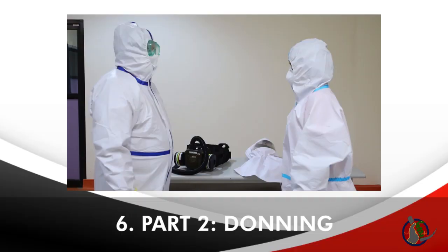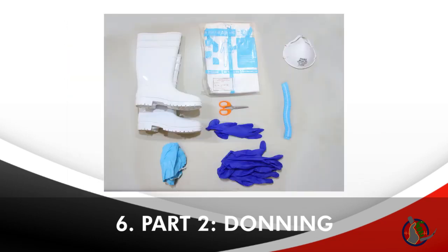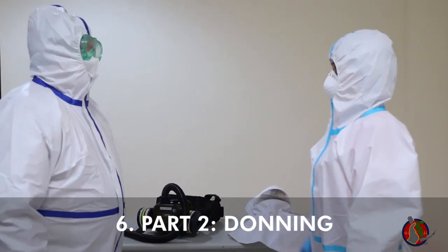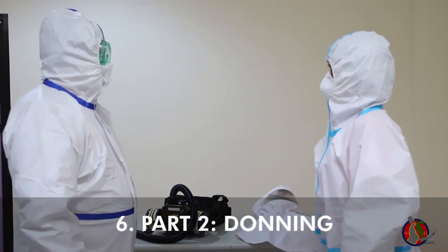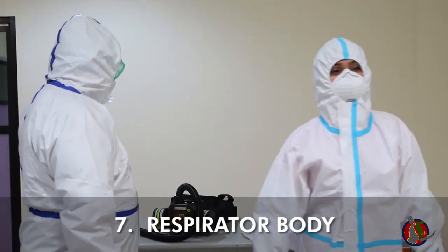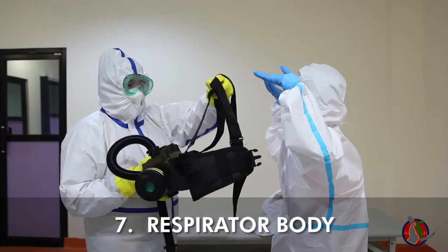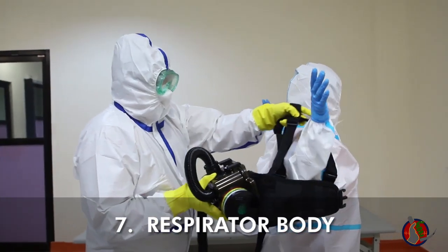Donning the PAPR is a two-person task. The PAPR is donned after donning the second layer PPE, skipping the goggles. Make sure you have your buddy with you before initiating PAPR donning. With your buddy standing behind you and carrying the PAPR body in its carrier belt, don the PAPR as you would a backpack.